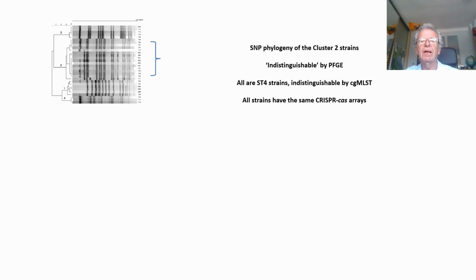Then we've got these, pulse type 2. These strains were roughly indistinguishable by pulse field. You get some strains which give no results whatsoever, and then certain experimental variation. So indistinguishable, in inverted commas, there.